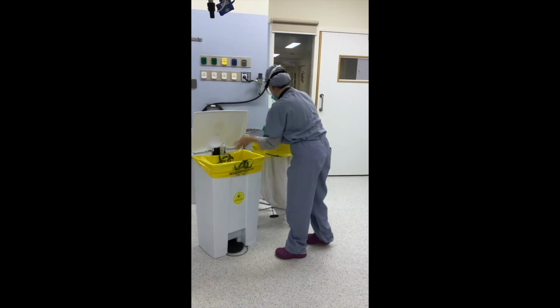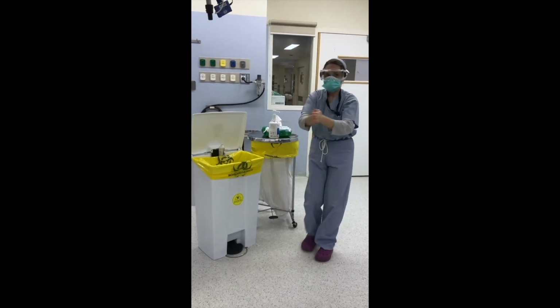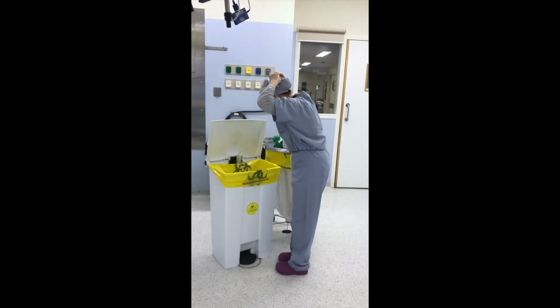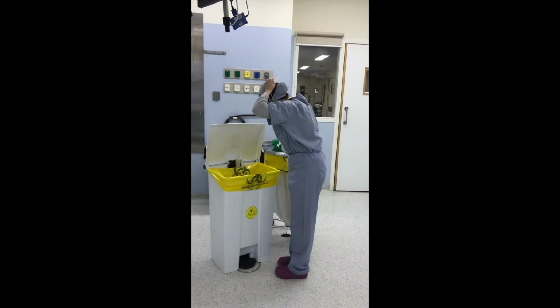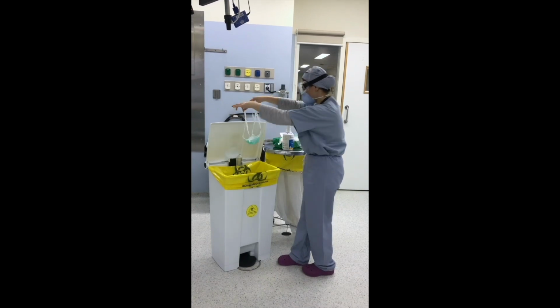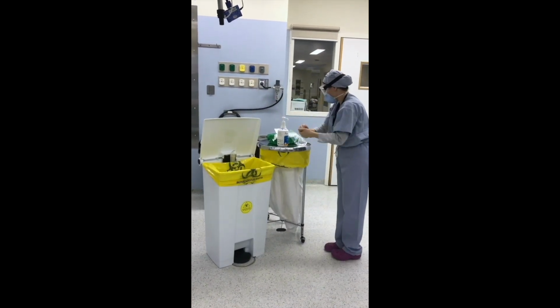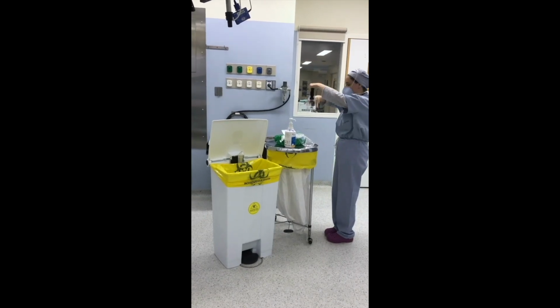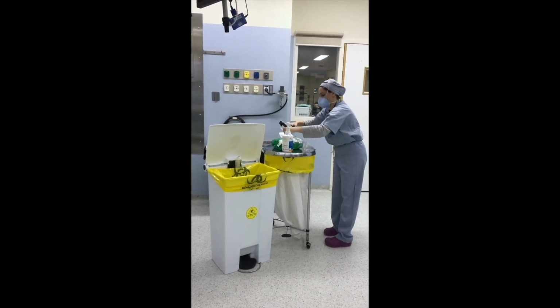Remember to wash your hands between each and every step. Next, remove your outer mask. Don't touch your face. Remove your goggles. Wipe them and conserve them in a plastic bag.